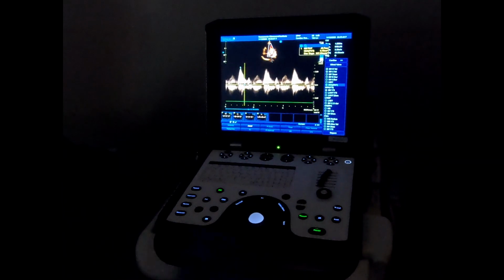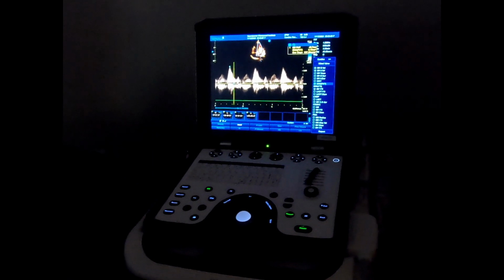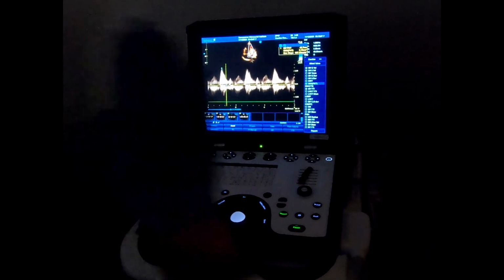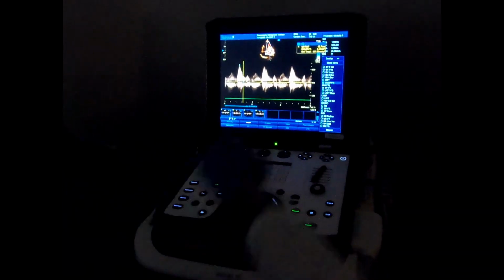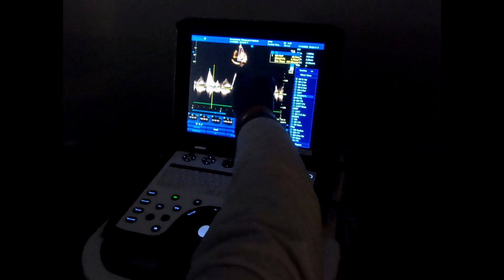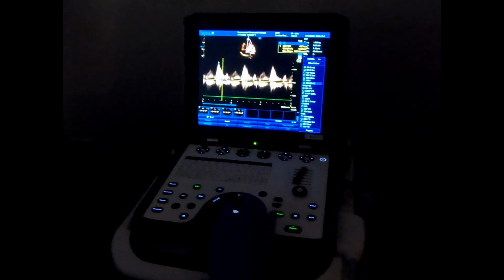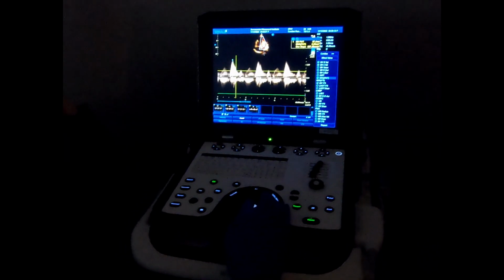No, I just gave an example of a bad pressure half time measurement. You will get confused how to measure if all your waveforms look like that. Then I ask you to follow the initial slope. See that this one is the initial slope? So this is not going to provide you the slope. The first one is the slope. So where would you stop it on that waveform? For this one, you need to stop at the beginning midway.